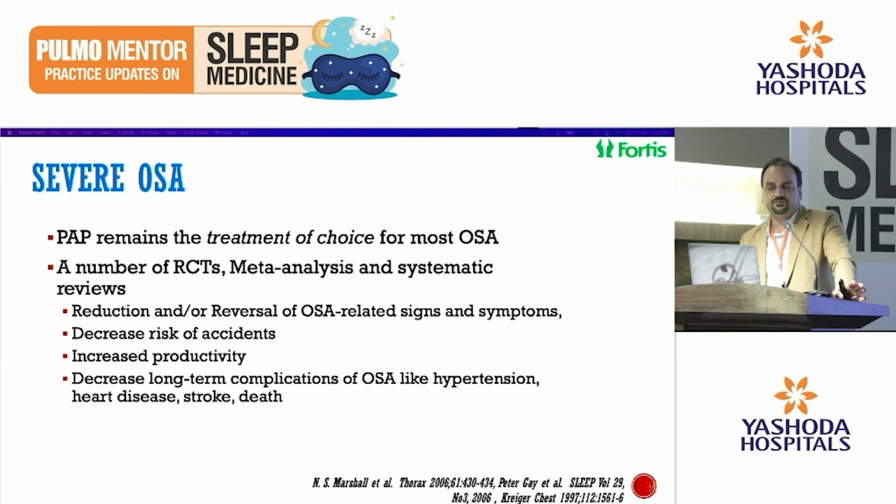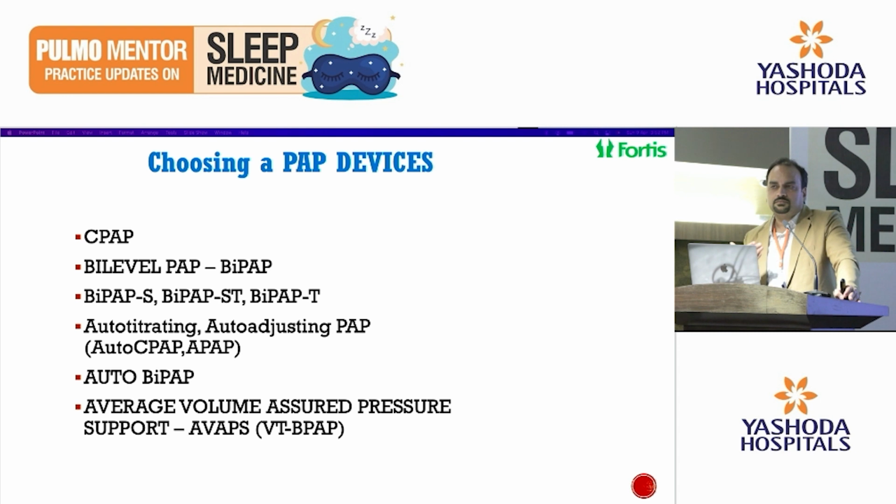For severe OSA, beyond any doubt, it is the treatment of choice for most of your patients. A number of RCTs, meta-analyses, and systematic reviews have been done, which showed that it gives you overall improvement in terms of quality of life, daytime symptoms, and long-term complication prevention. So this is the therapy that is a must for all sleep apnea patients.